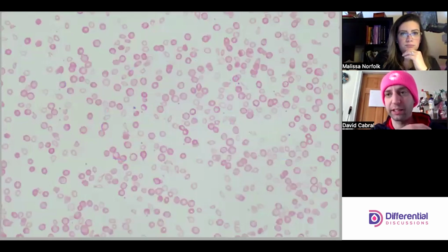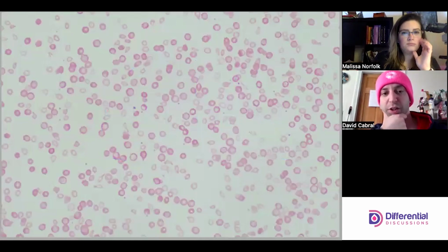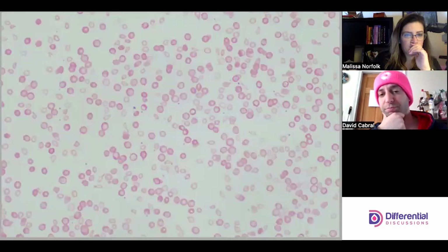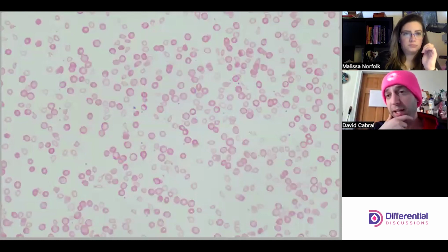When I see something like this, the first thing I think of is transfusion. But certain pathologies can have different clonal populations, and they can produce this spectrum of red cells. So there's definitely a size differentiation here. I can see those two sizes, but I can also see the hemoglobin concentration of these two populations is vastly different as well. Very, very fascinating.